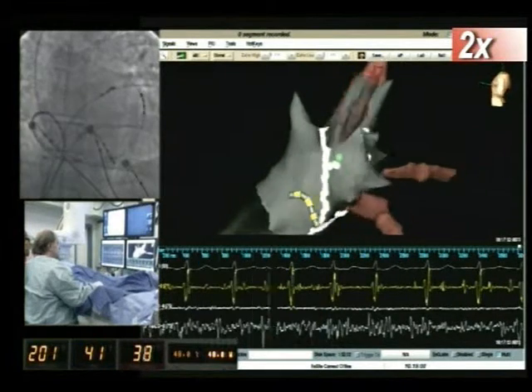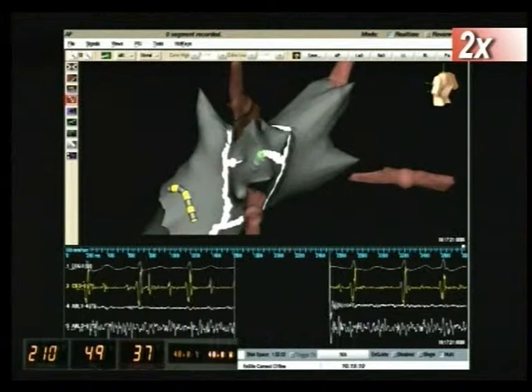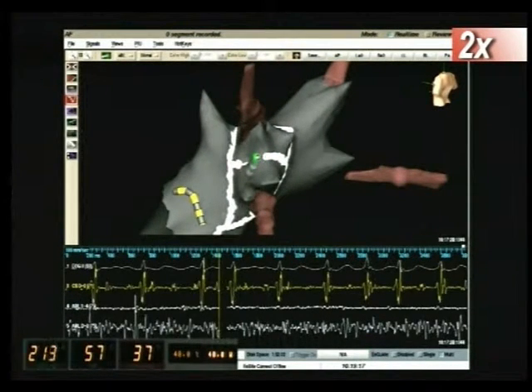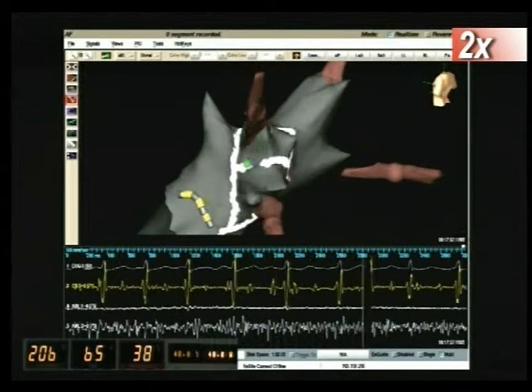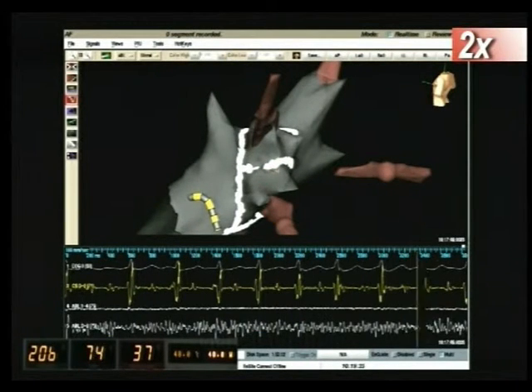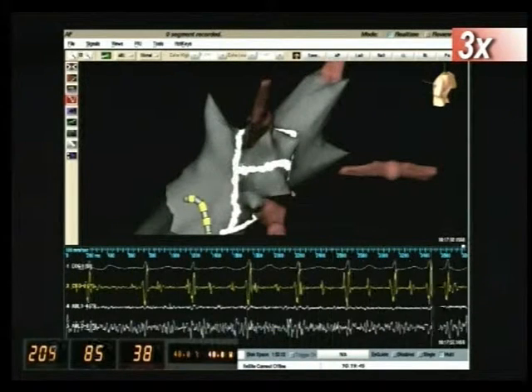Unfortunately, sometimes this is not possible because of the anatomical variability of the pulmonary vein insertion. Variants, such as a common ostium or additional pulmonary veins, may be present. This is a very challenging region considering its location between the two pulmonary veins ostia. However, in this case, no difficulties were encountered.